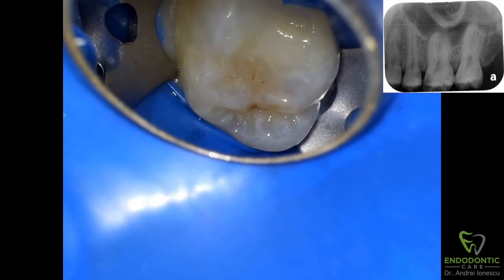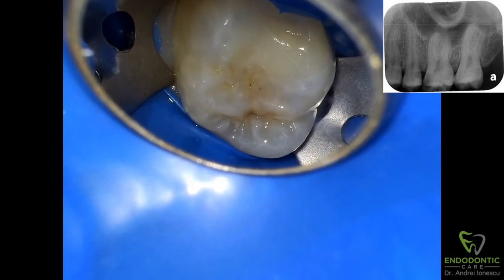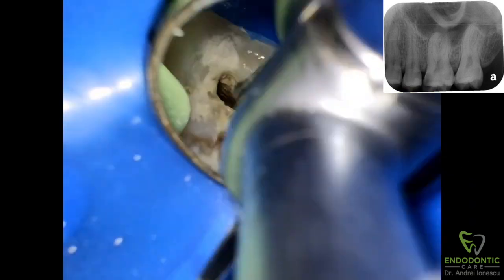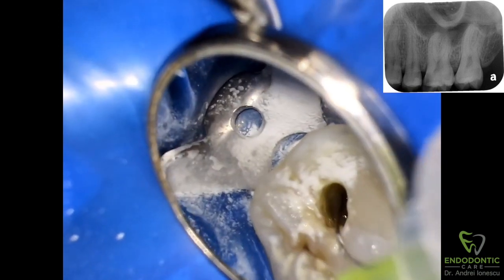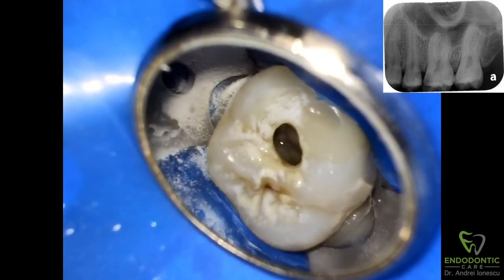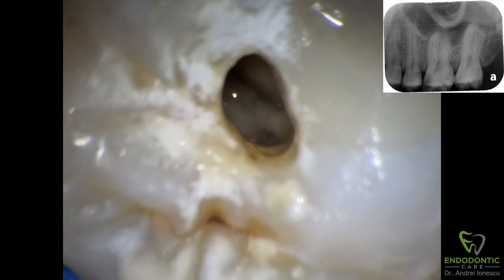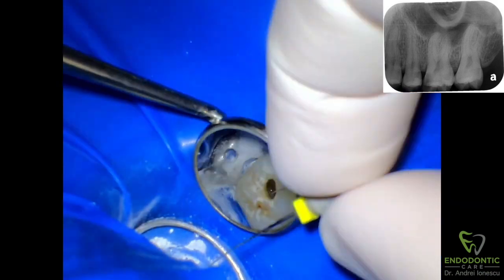After removing the mesial caries and restoring the tooth, I began making the access. This is my initial access — I felt it was large enough so that I could see all the canals and take a good look inside — and we start working on our glide path.